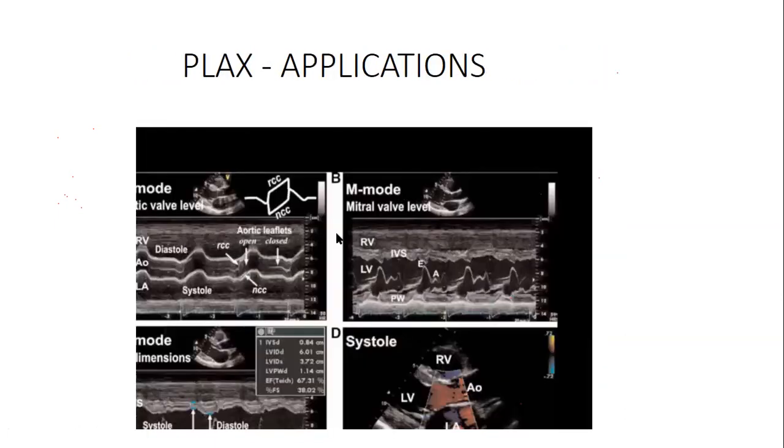Okay, I talked about it. You find that it will give you this box thing that we are talking about. So remember, I said this is in diastole. This whole thing here, this tubular-like thing here, it's the aortic root. It's in diastole, systole, diastole, systole. The cycle continues.